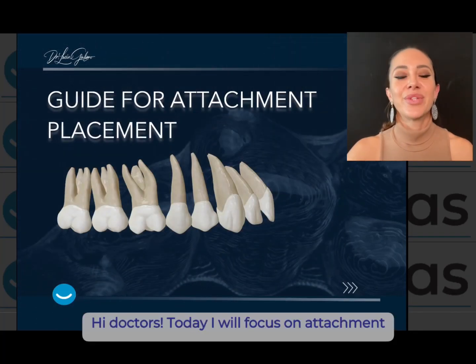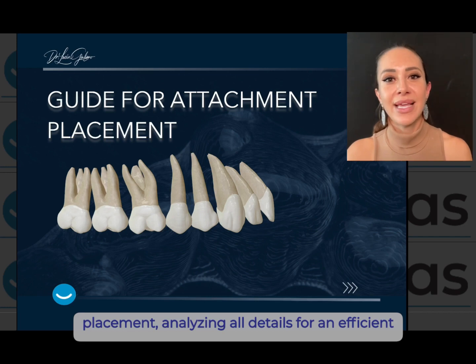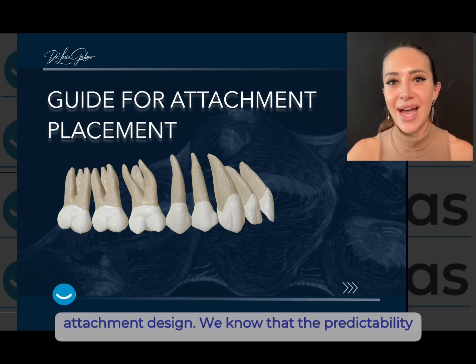Hi doctors! Today I will focus on attachment placement, analyzing all details for an efficient attachment design.